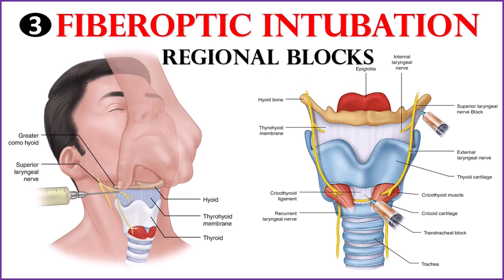Hello everyone and welcome back. In our last video, we looked at different methods of topicalizing the airway in preparation for fiberoptic intubation. In this video, we'll go through the regional blocks that are used for numbing the airway.